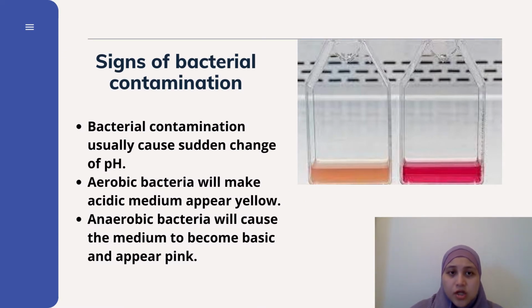Signs of bacterial contamination. These slides show two flasks with different color of media. Bacterial contamination usually cause sudden change of pH. Aerobic bacteria will make acidic medium change the color from pink to yellow, whereas anaerobic bacteria will cause the medium to become basic and appear more pink than usual.